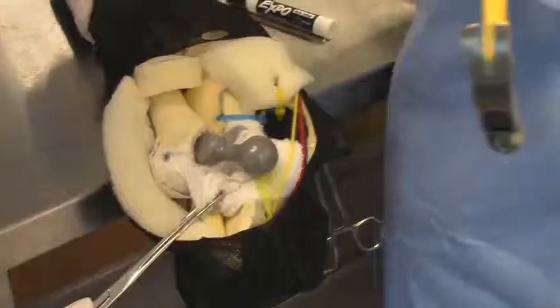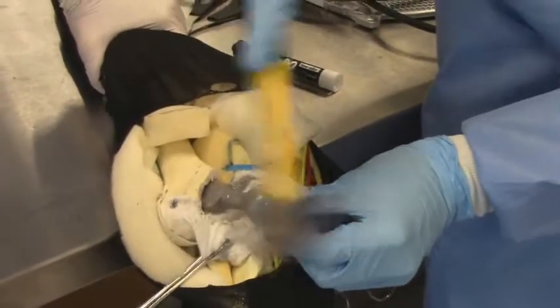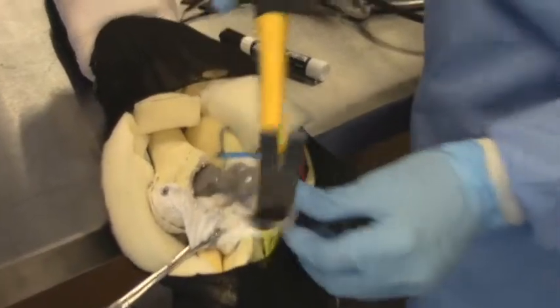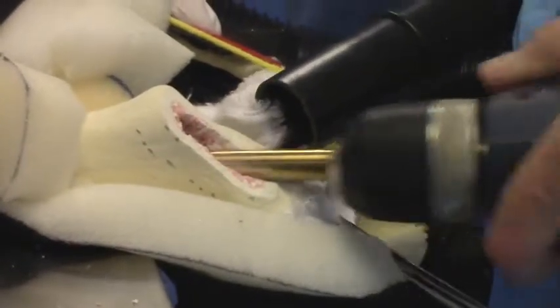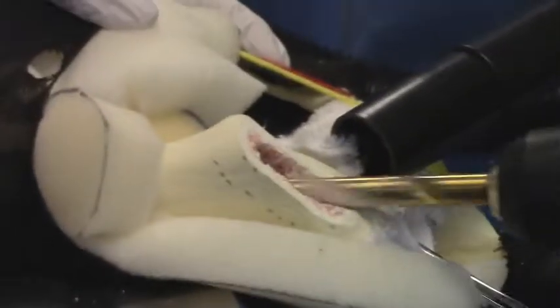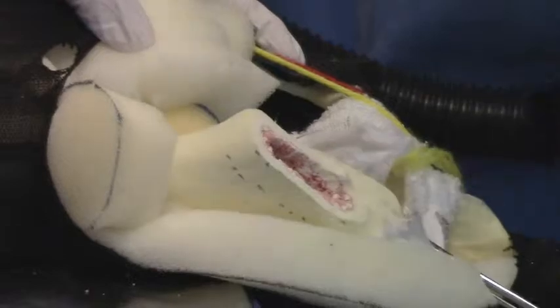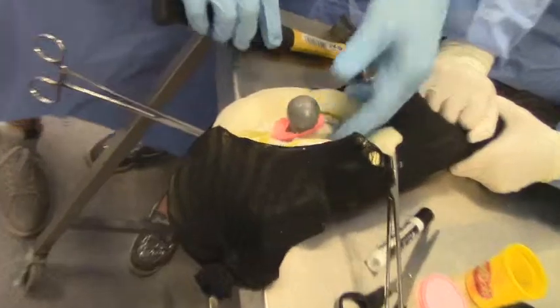When you think you are ready for a dry fit, tap the femoral component into place. Be gentle. It is very easy to fracture the bone with the wedge-shaped femoral implant. If you do fracture the bone or the implant won't fully insert, remove the implant and continue shaping the interior of the femur until there is a good fit. You don't have to get things perfect because bone cement acts as a mold and a buffer between the metal implant and the softer bone.